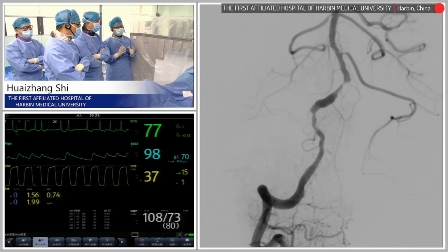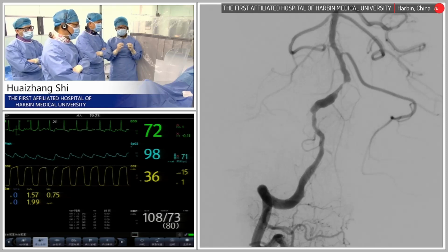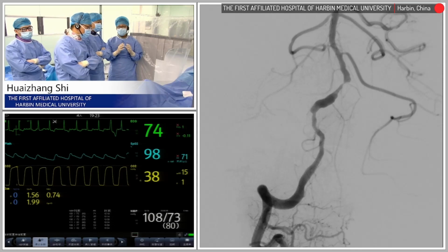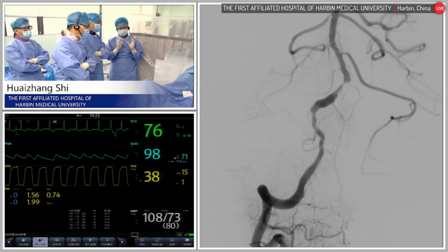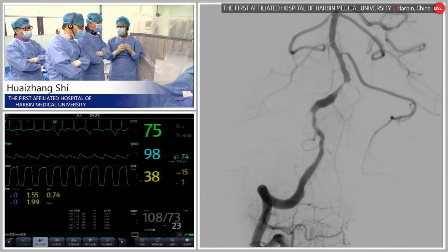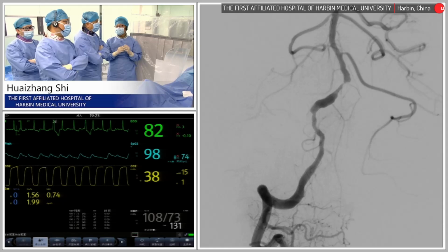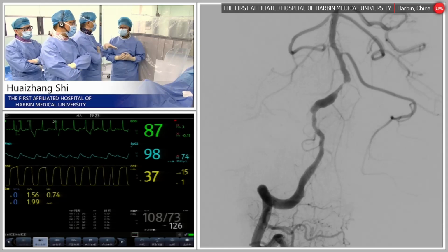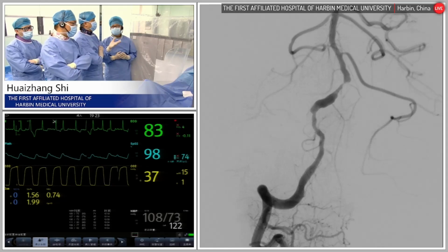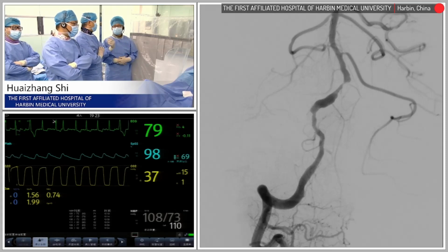Okay. So I have a question about this case because you just told me the right side is the dominant one, and the left side, the stenosis is very severe, almost totally occluded. But so you are going to leave that because it's caused by dysplasia, or because it's not the dominant side? Yes, because it's not dominant. Maybe it's a dysplasia. So we don't need to treat it.